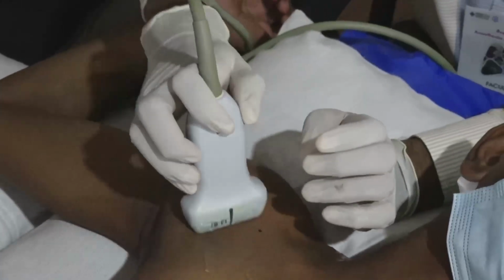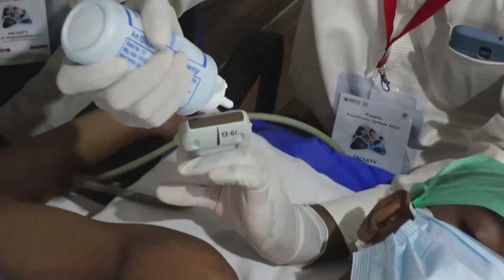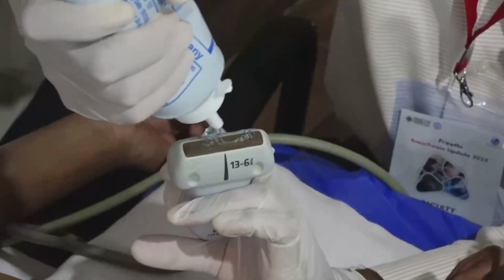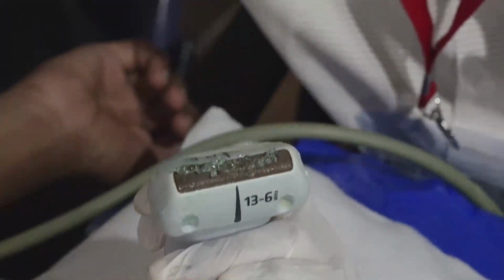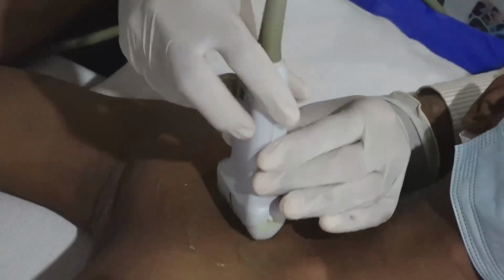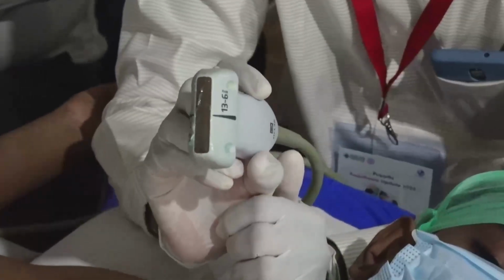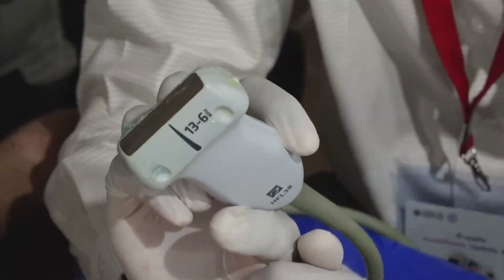The idea of giving costoclavicular block is that the components are very dense, and the other idea is to move further away from the phrenic nerve.